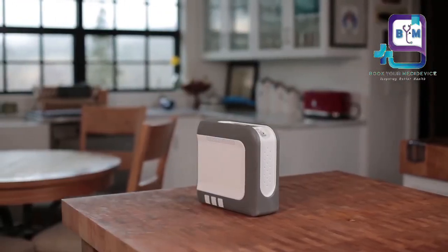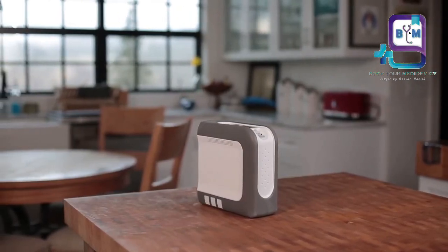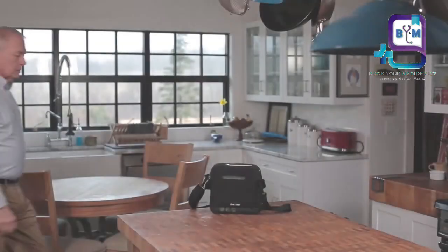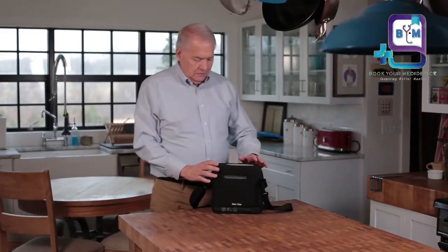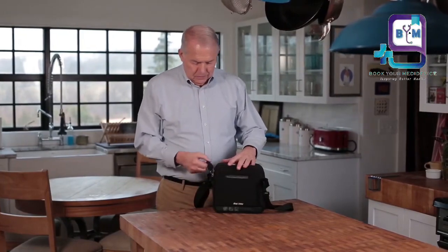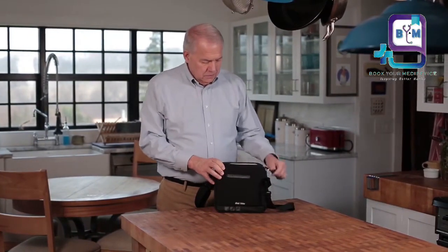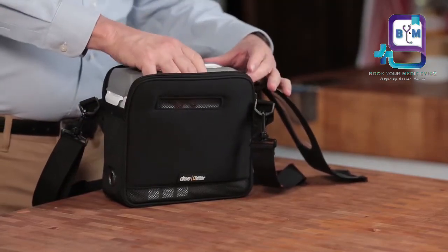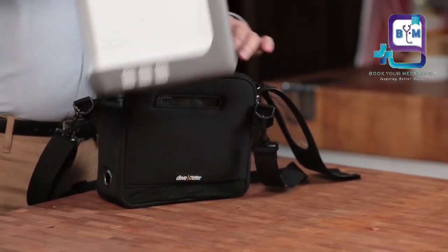Welcome to the iGO2. Today we'll review the essential parts that are included with your iGO2 portable oxygen concentrator. The iGO2 ships in the carrying case. Carefully unzip the carrying case, remove your iGO2, and review the contents to ensure that you have received all of the necessary parts.